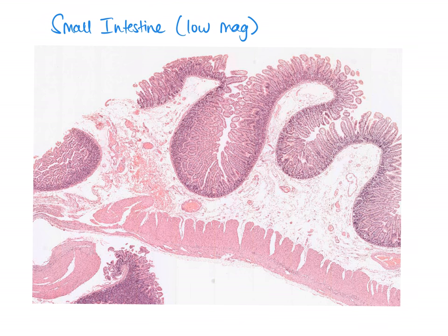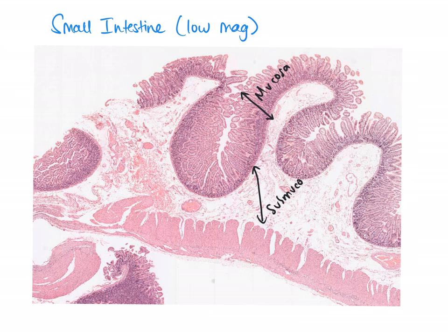Continuing down the gastrointestinal tract to a low magnification image of the small intestine: all four layers making up the wall are really obvious here. We have the mucosa layer, which is quite dark, then the submucosa layer — fairly pale but in real life tends to be denser — then the muscularis layer, which enables peristalsis, segmentation, and mixing of food with acids, and finally the serosa layer, which keeps the small intestine wet and slippery to reduce friction.